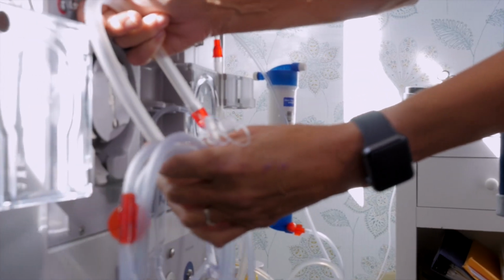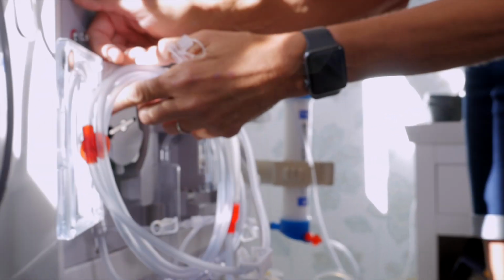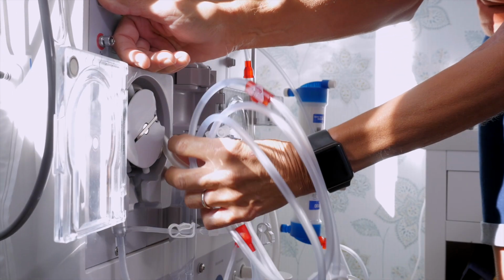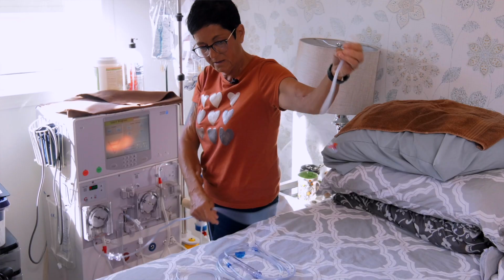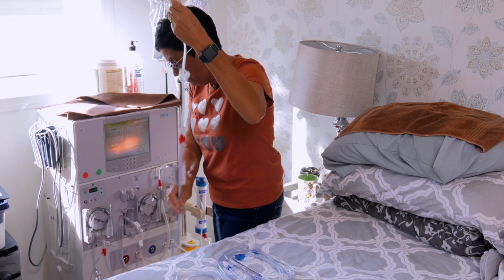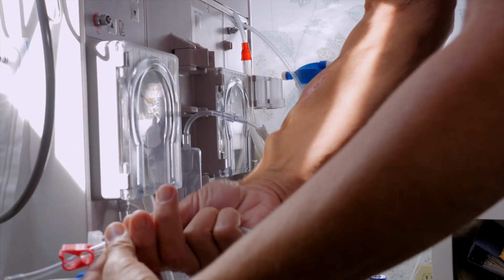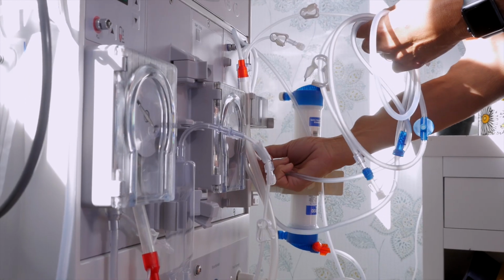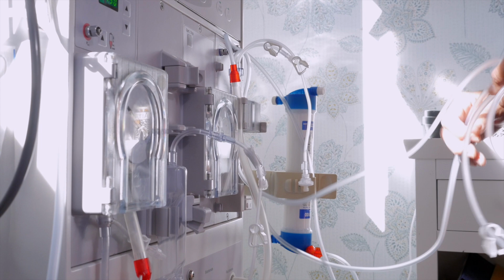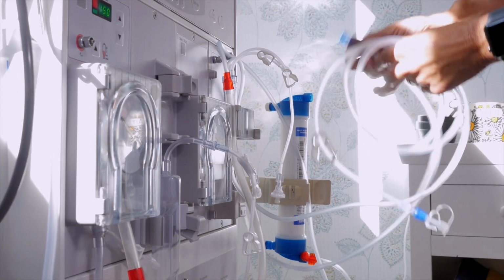And then I'm a single needle user, so I use 2 pumps. If you were to use 2 needles, you would only have 1 pump on your machine, and your setup would be a little different than this. Not too much different, just only the 1 pump wouldn't be there. And this is my venous line, which will be returning my blood.